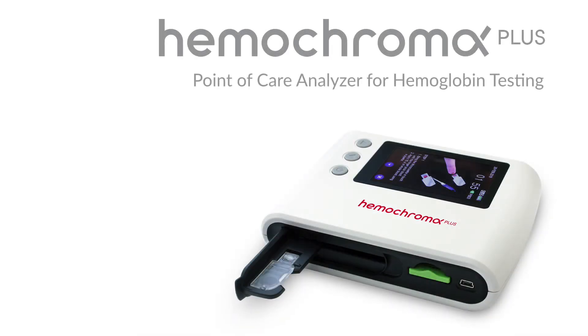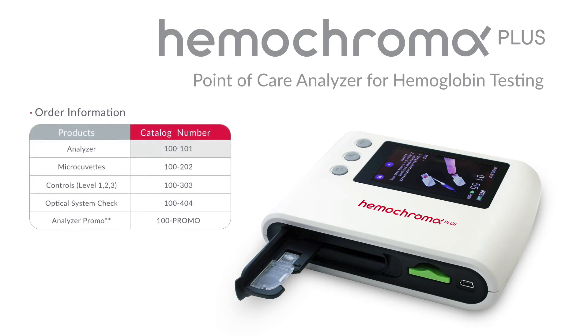The Hemochroma Plus Analyzer item number is 100-101. For more information, visit us on the web at immunostics.com.